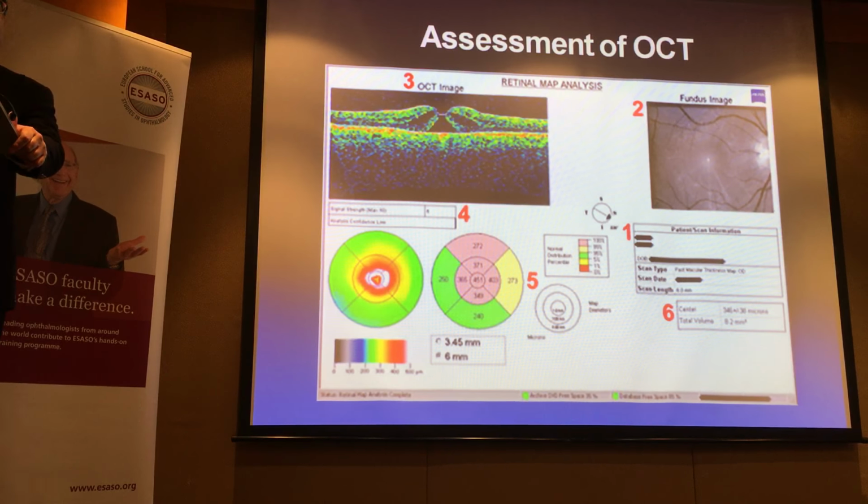And it's still done obviously for clinical trials, right? They always talk about central retinal thickness, central subfield thickness, and how it changes with the drug. This drug makes it go down faster, and stays down, and sawtooth appearances, all of that. So that's useful, but in clinical practice, I'm not treating a number.